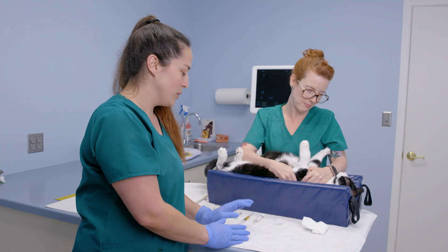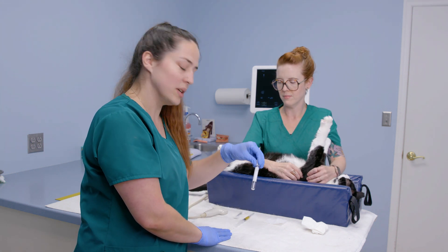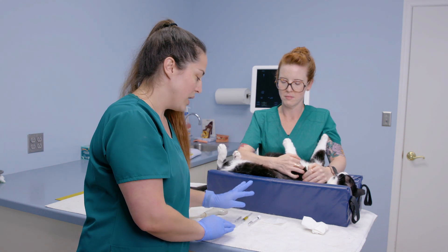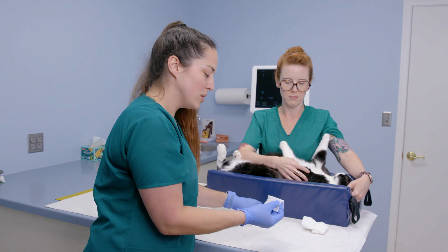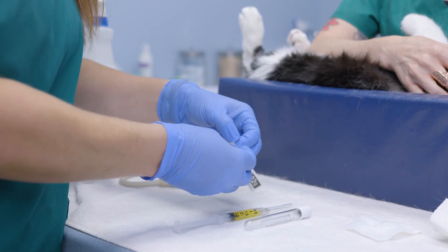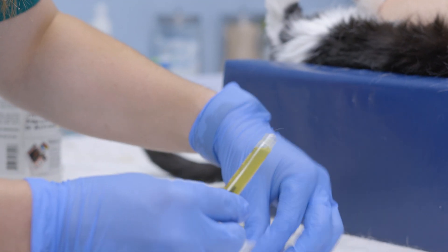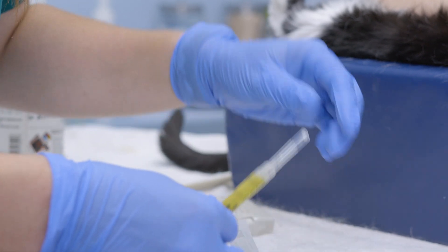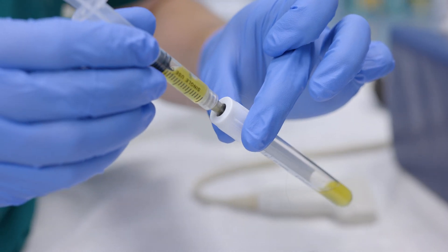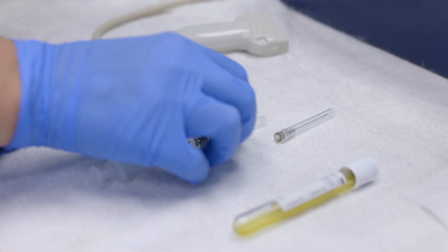We're going to place our urine sterilely into our tube. We have a white-top tube and a new needle to change out from the syringe to maintain sterility. We'll wipe the top of the tube with alcohol-soaked gauze. Then we'll open the new needle, remove the old needle from the syringe, apply the new needle, take the cap off, and insert the needle into the top of the white-top tube to collect the urine sample. Then recap the needle to make sure no one gets poked.